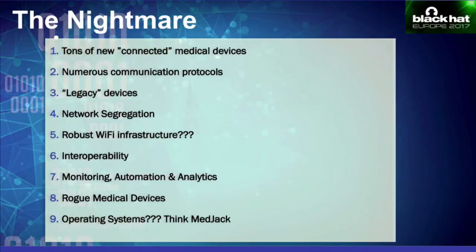Segregation of data could be a big problem because we've already established that there is a lot of malware and ransomware trying to target medical devices because of some of the issues in there. So keeping these devices on the same network as your hospital billing system could be a problem as well. And then patching. You can think of these medical devices as industrial control systems. Actually, in a way, they are industrial control systems.